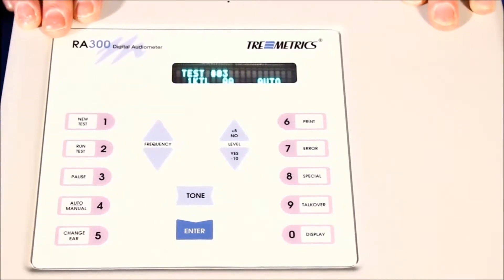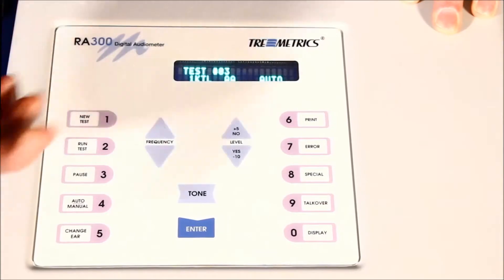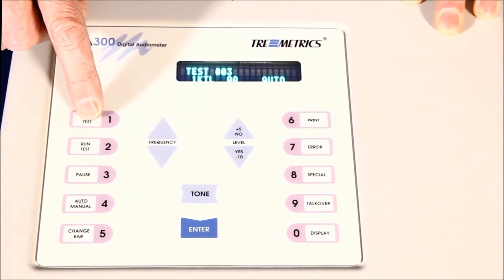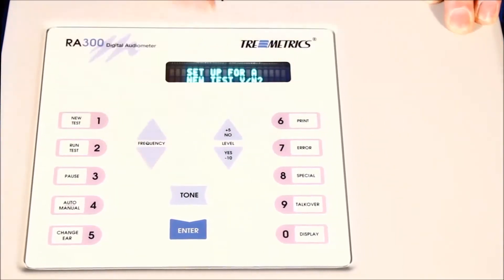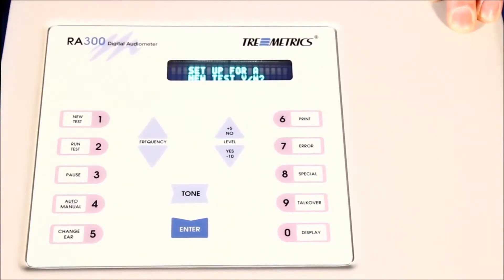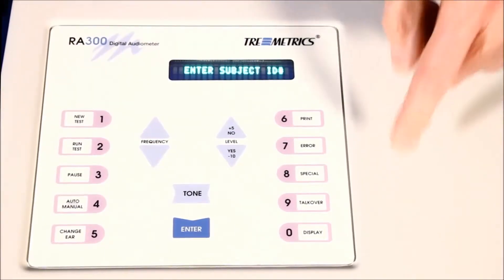I'd like to show you how to go into a standard automatic test sequence for the device. It's simple — you push the number one or the new test button, and it asks you if you want to set up for a new test. The arrow keys here are yes and no answer keys as well, so yes, I'd like to set up for a new test. We can enter a subject ID.